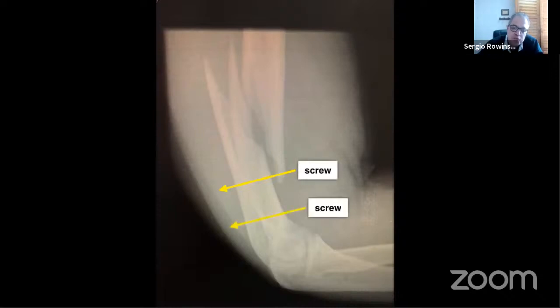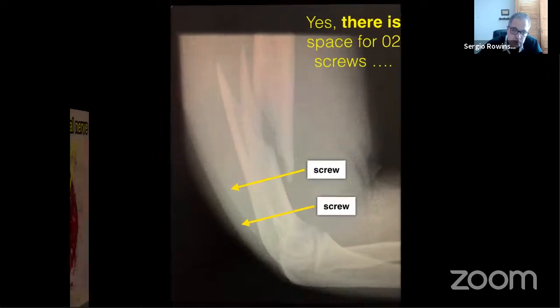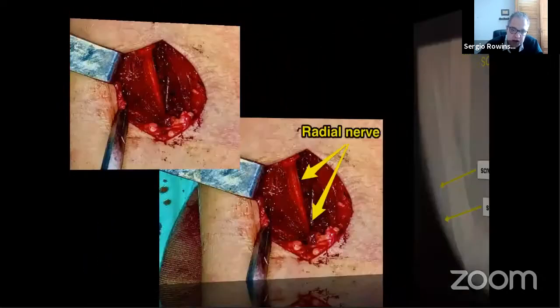Another tip, as inconvenient as it is, go to the radiological department and get a lateral view. You have a better understanding. So I can put 1 screw here, I can put another screw here. With 2 screws, I can always do the job. In this case, there's no place for mistakes. This is not a case for beginners.